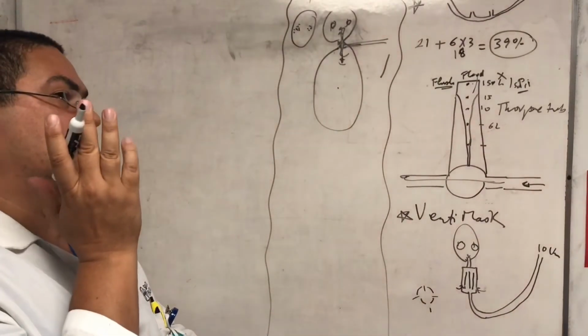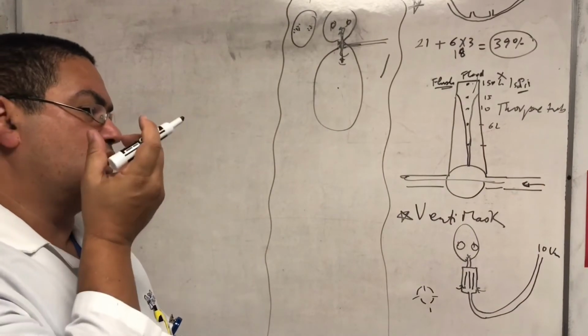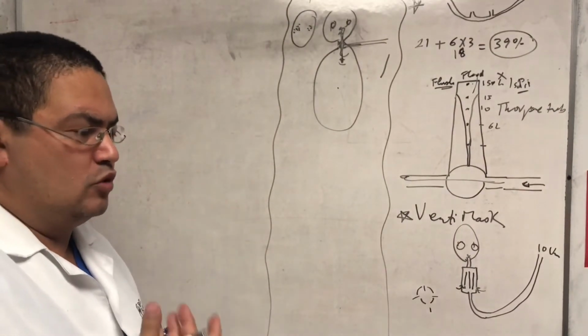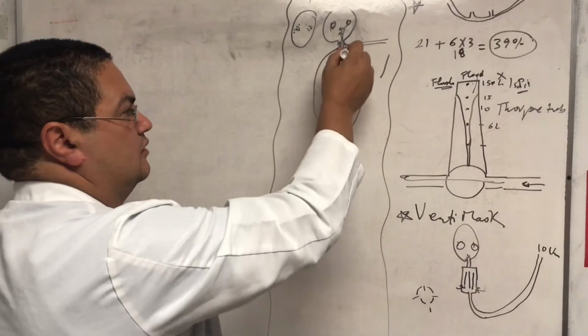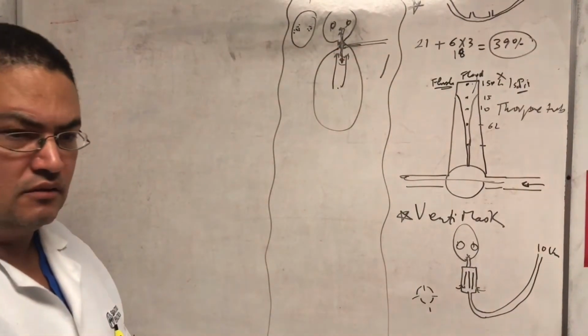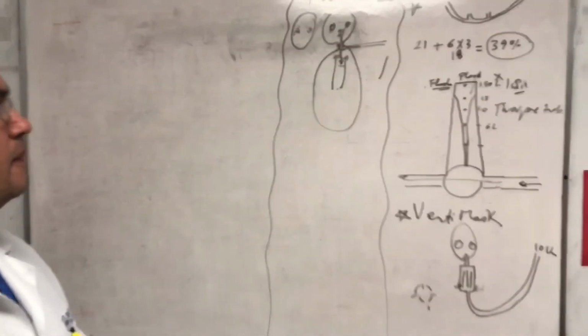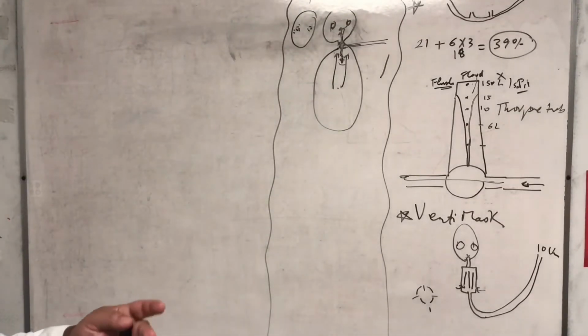Like this, that small disc will just suck in, so it prevents the amount of entraining that happens, but most of the entraining happens from here. But that doesn't say 100%. Still, my nose is big, it will go from here, stuff like that. So the non-rebreather mask gets you close to 80% or so.